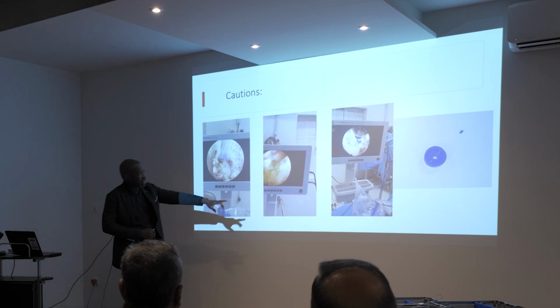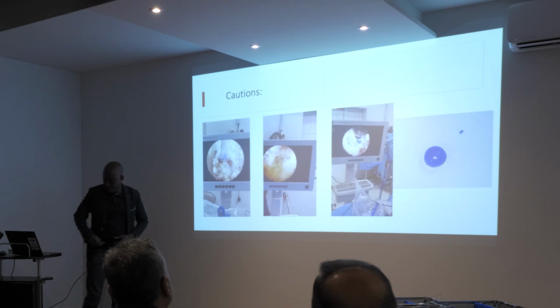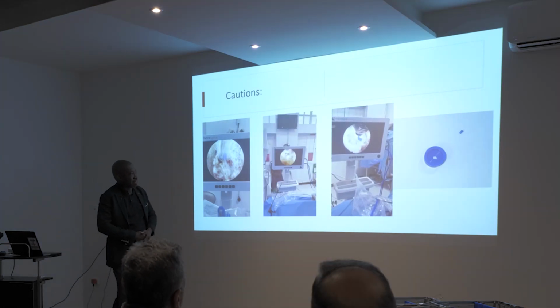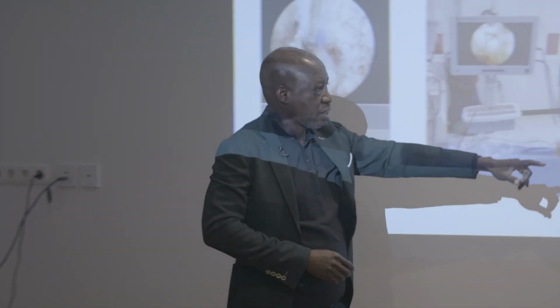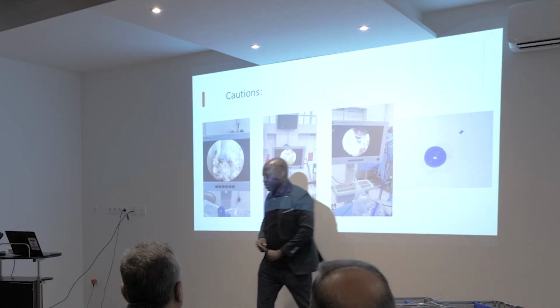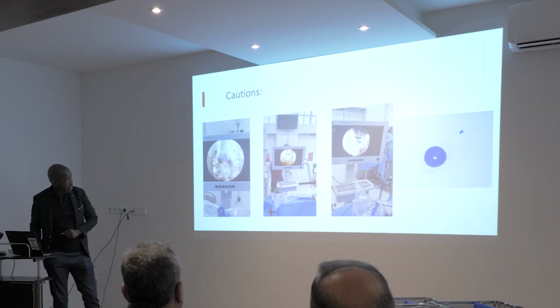Or here, the head of the cap also got detached. You can see, so we had to retrieve it. So if you are not so cautious, you can just leave it behind. It can be a source of infection. You can see here, just a small fragment got detached. So we have to be extra cautious while doing these surgeries.